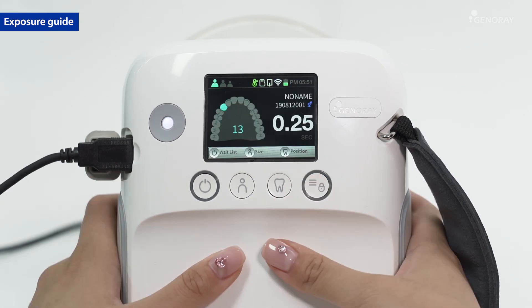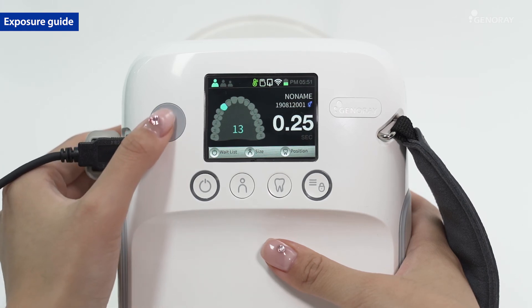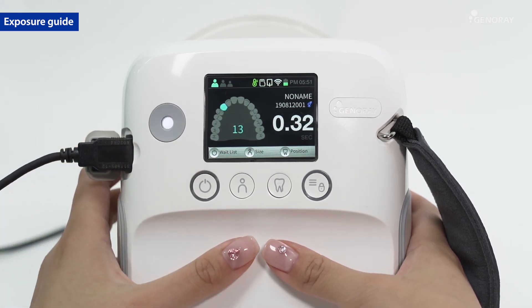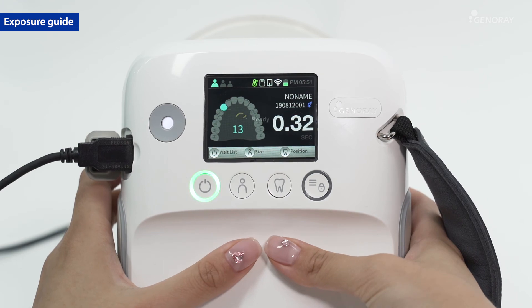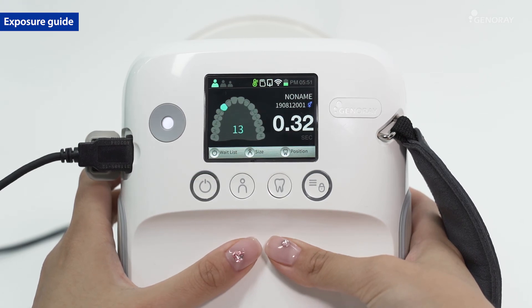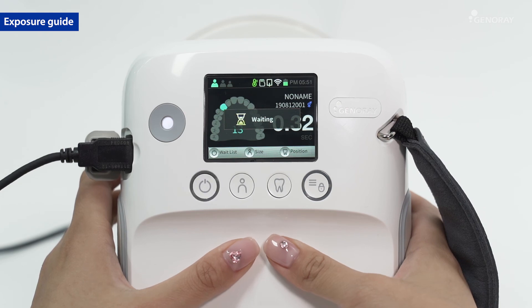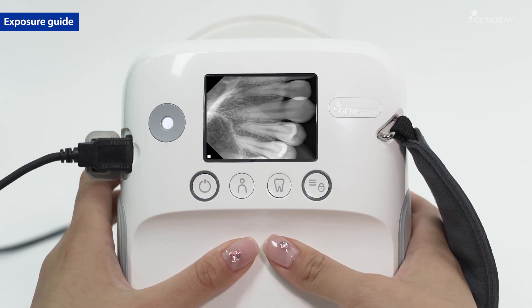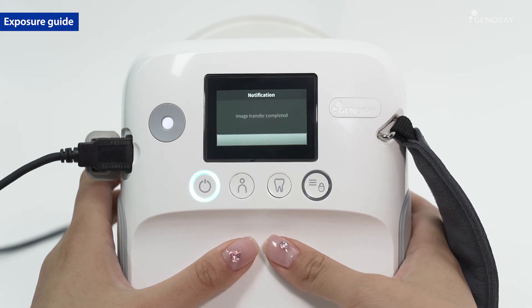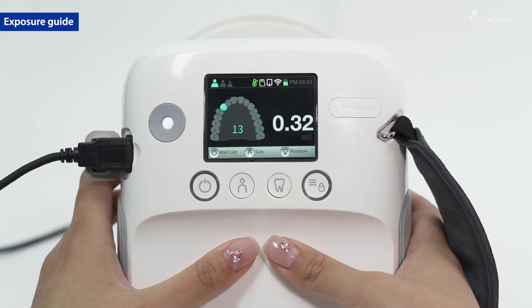If the image quality is not preferred, you can change the exposure time by rolling the trackball up or down. Please hold down the X-ray button until you hear the exposure beep. All presets will automatically be saved once you change the exposure time.